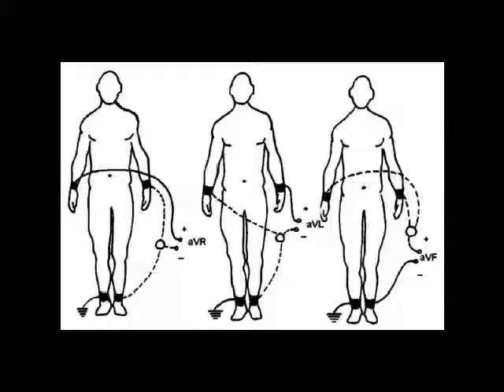For augmented or unipolar limb leads. The 3 augmented unipolar limb leads compare one limb electrode to the average of the other 2, which is called the Goldberger method. 2 of the limb leads are connected through electrical resistances to the negative terminal of the electrocardiograph, and the third limb is connected to the positive terminal.